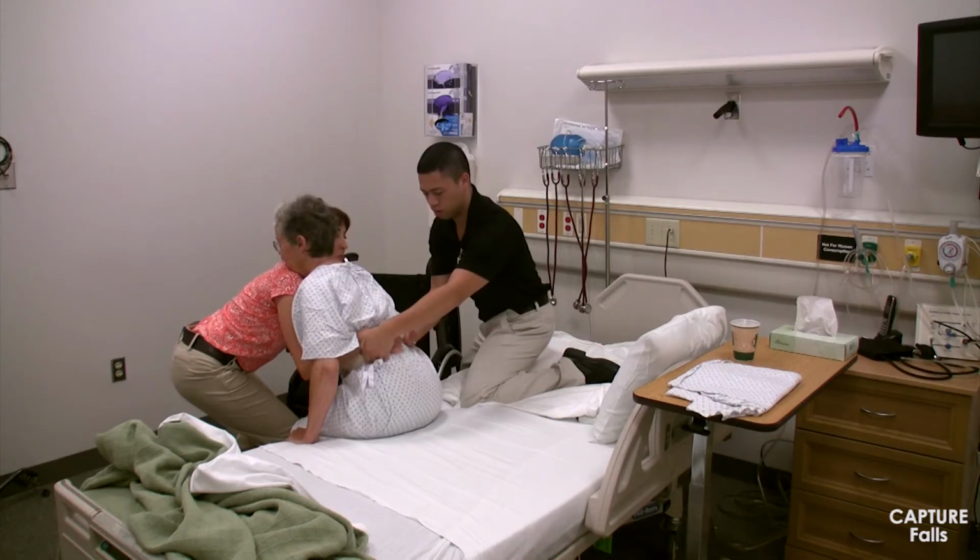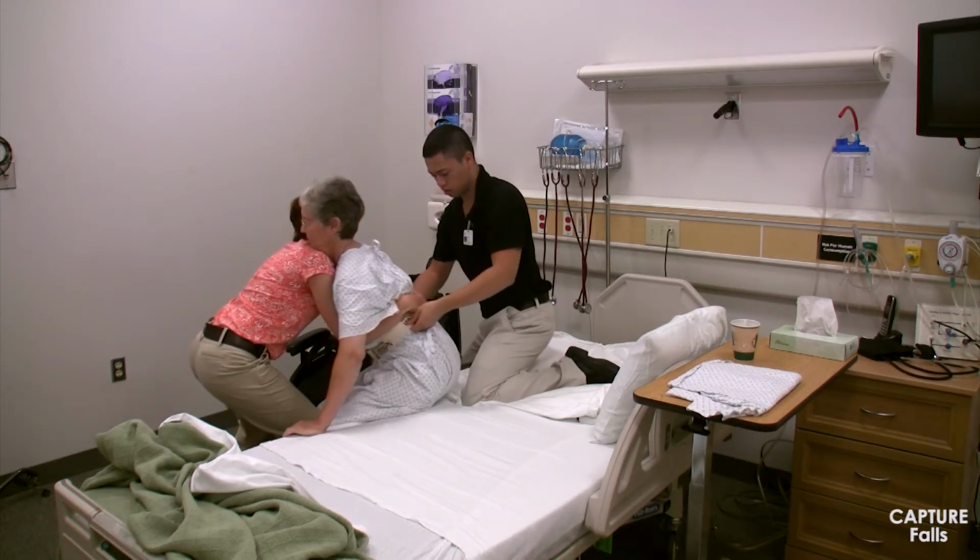Once the patient's hips are raised off of the bed, you can then pivot with the patient to assist her towards the chair. Given your foot position, you should be able to pivot fairly easily to move the patient towards the chair. Don't simply pull up on the gait belt. This is uncomfortable for the patient and increases your risk for back injury.